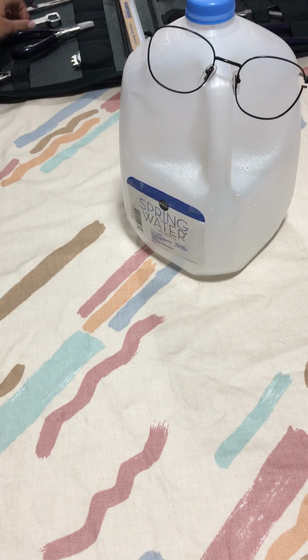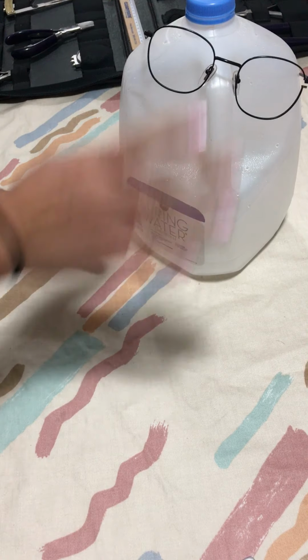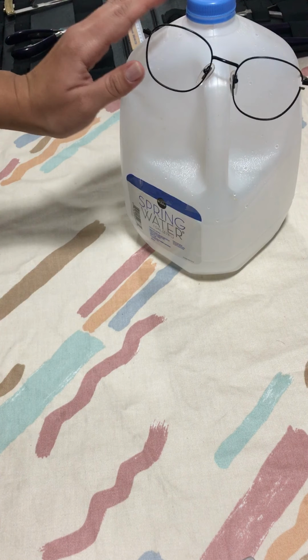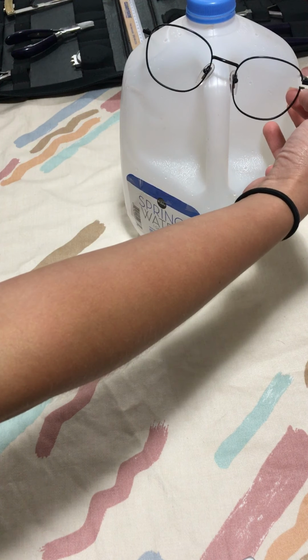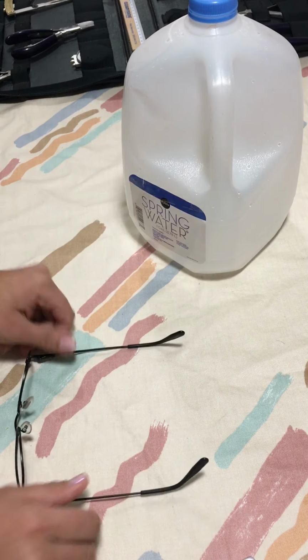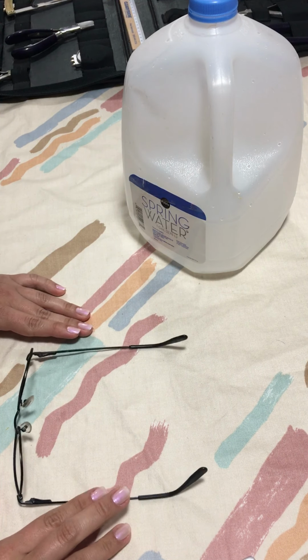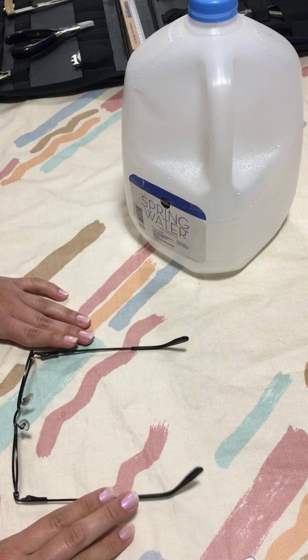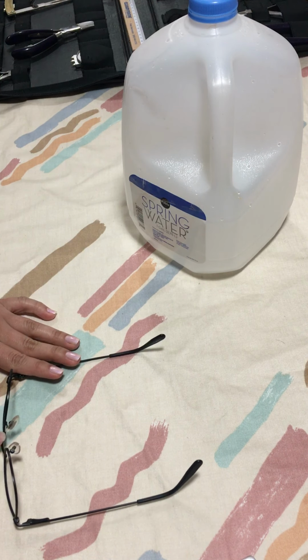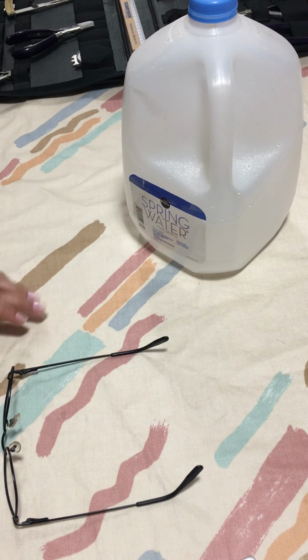I am gonna be using the wide angling plier right here. I'm gonna be working on this side just because on this one it's missing a screw, okay? But when I do put it on the table, I also notice that it's wobbly, okay? Which is another indication of temple parallelism. I check the bridge to see if there's anything wrong with the bridge. There's nothing wrong with the bridge, so it has to be the temple parallelism.